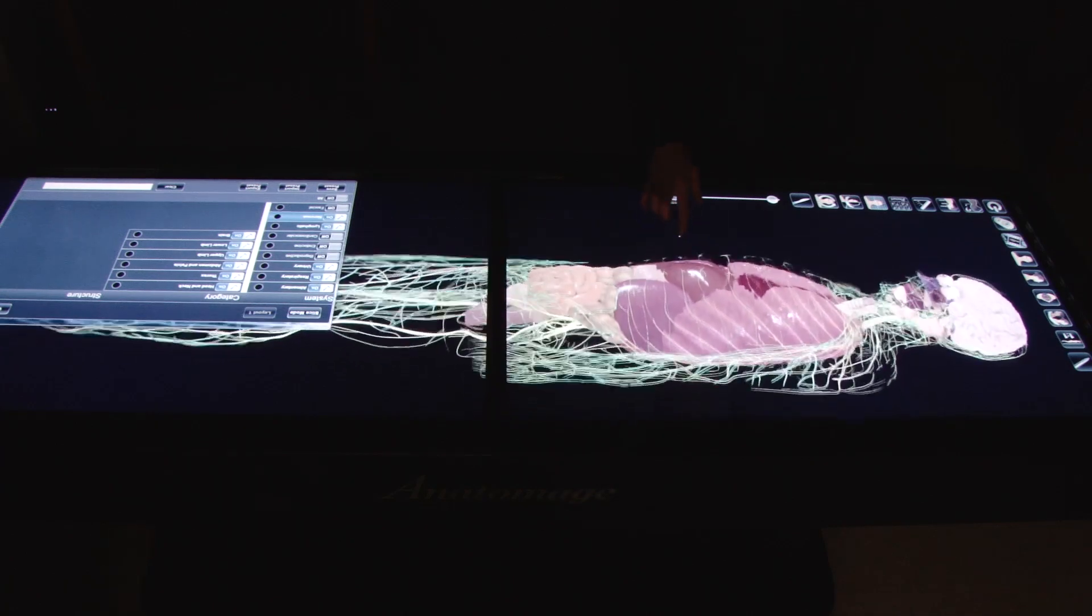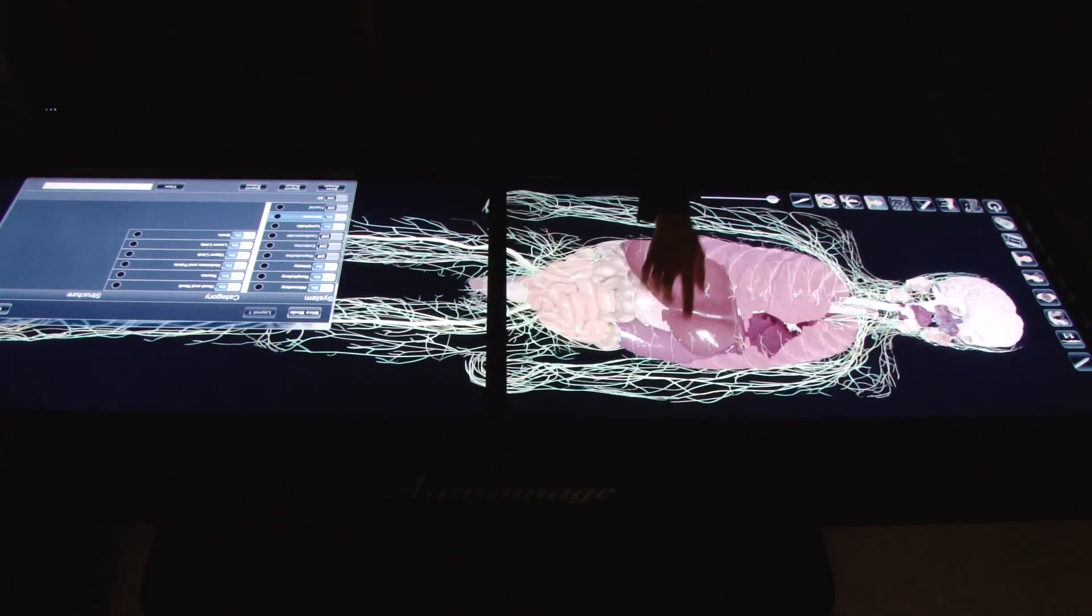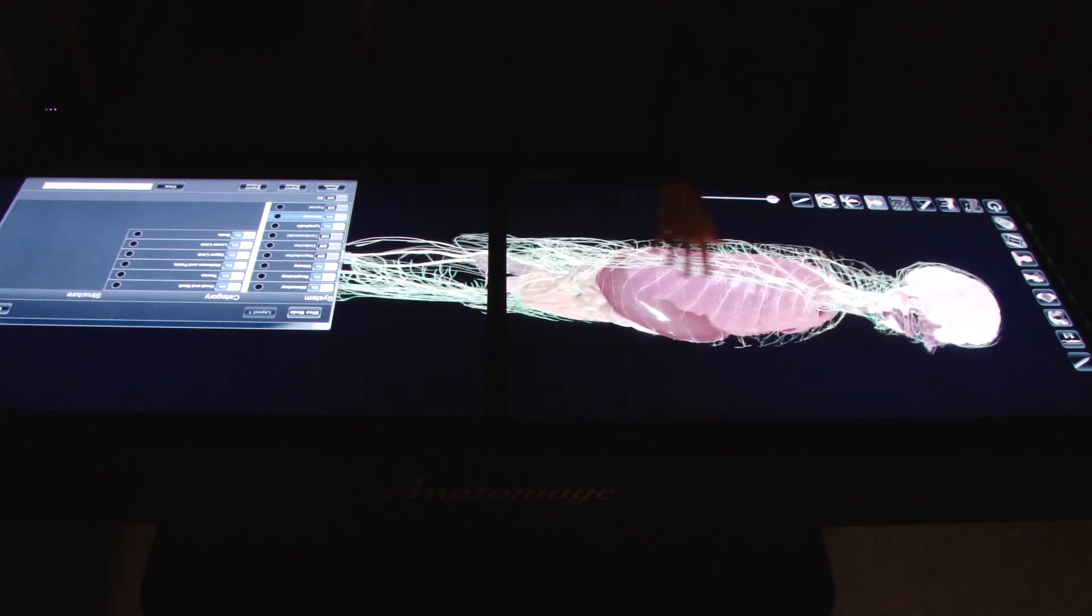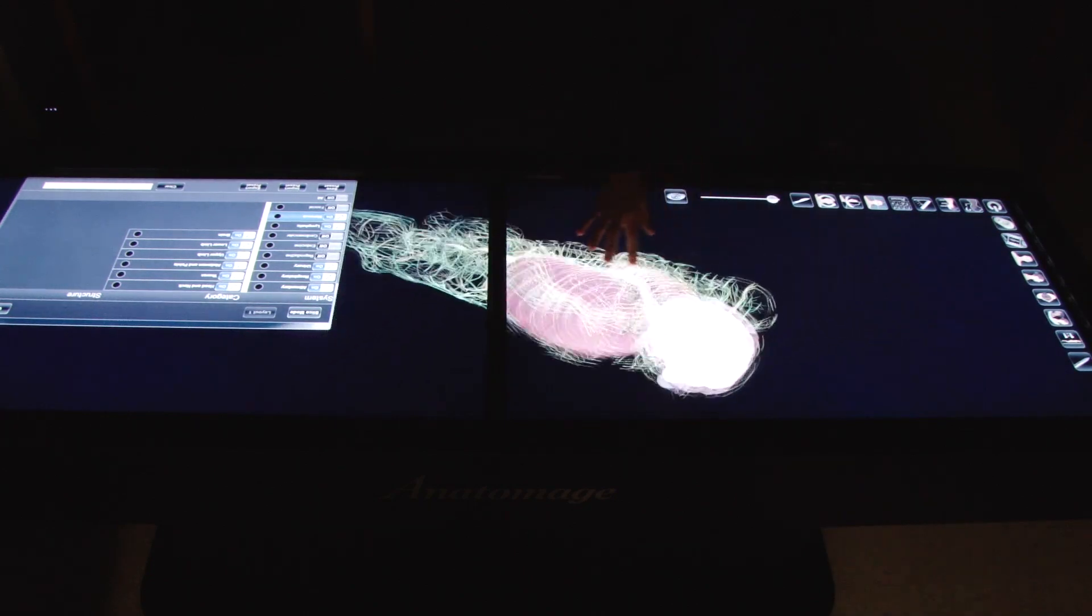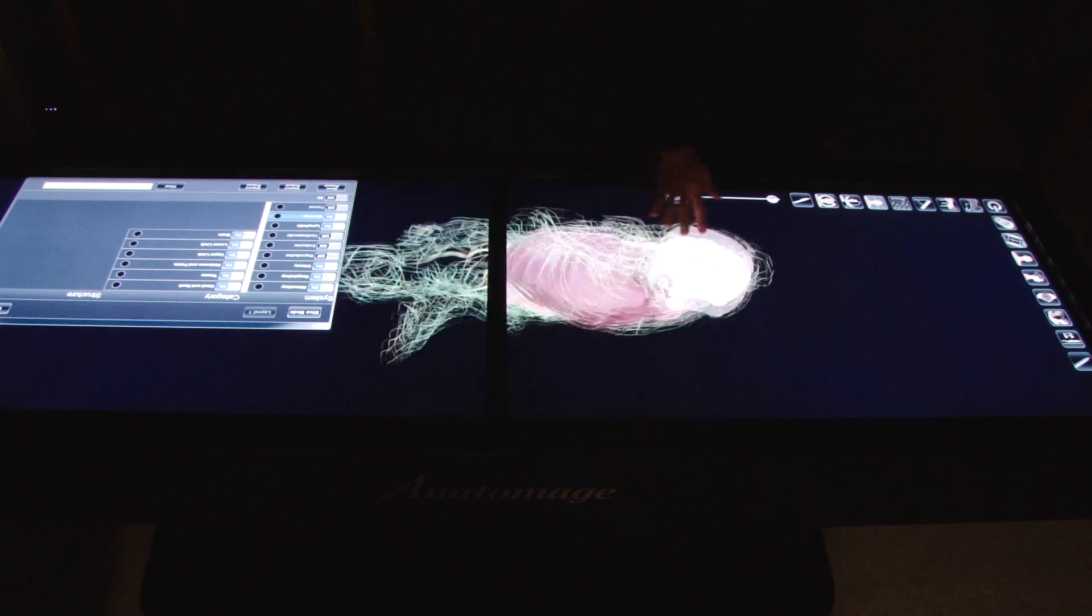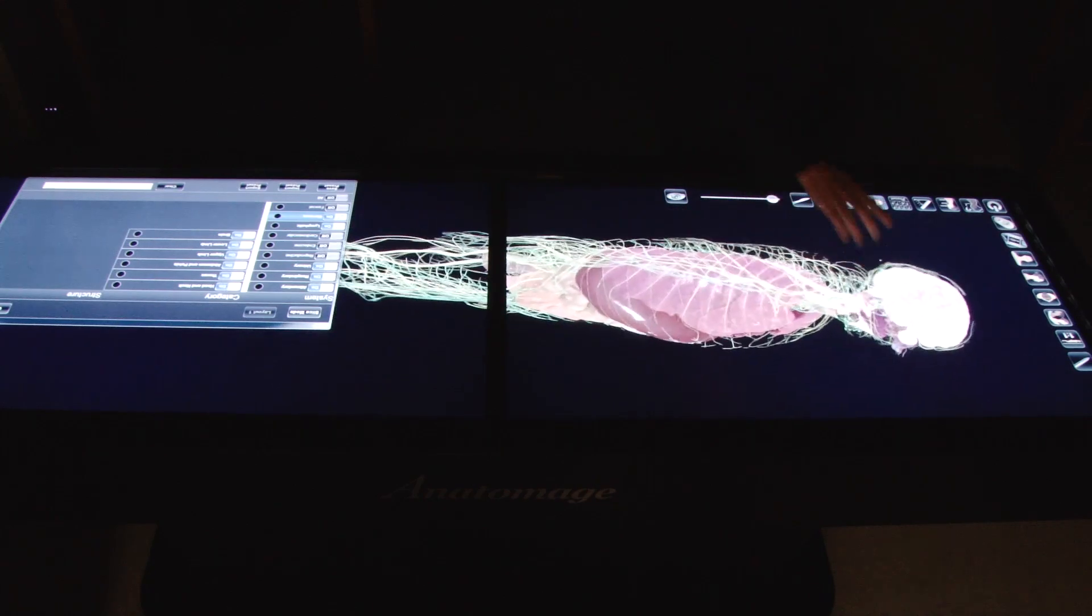In fact, this table allows students to isolate body systems such as the nervous system or the cardiovascular system or the skeletal system or muscular system, respiratory system, etc.